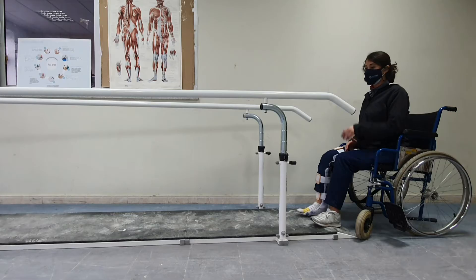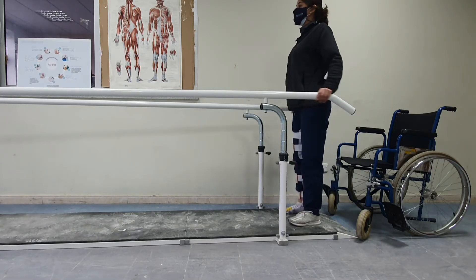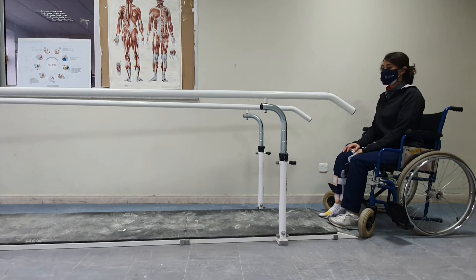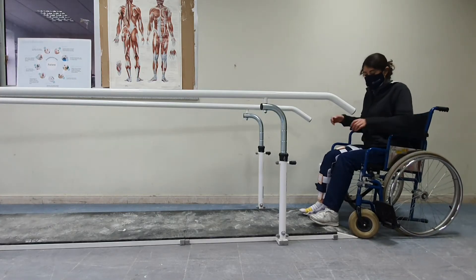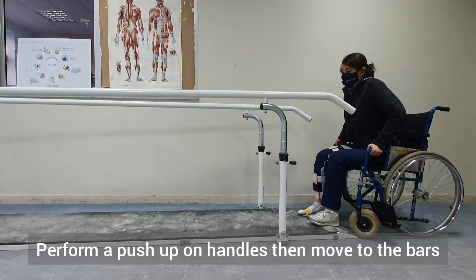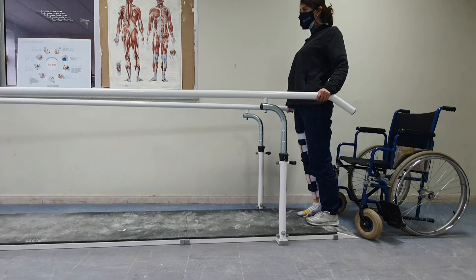To come to stand, the patient will start by pulling on the parallel bars. This is the easiest way to stand, but we are relying on the stability of the parallel bars. For future training, we teach the patient to come to stand by first putting on the brakes, pushing on the handles of the chair, then moving to the parallel bars to come to stand. The hinge automatically locks when the patient comes to standing.